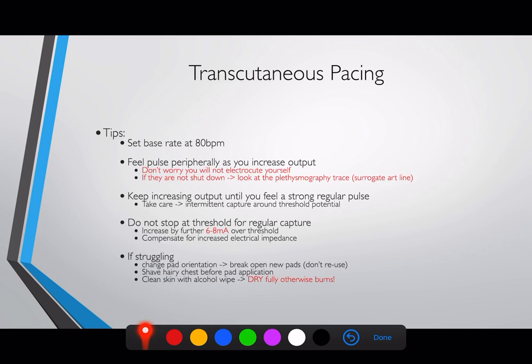Set your heart rate on the machine to 80 — that's a nice normal number for most patients, though you may need to adjust. Then feel for a pulse peripherally. I tend to go for the radial pulse, but when first starting it might be easier to feel for the carotid, especially if the patient is very hypotensive with a blood pressure of around 60. If blood pressure is above 80 you may be able to feel the radial artery. Then increase the output slowly, starting from zero.